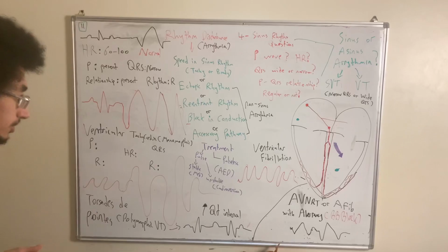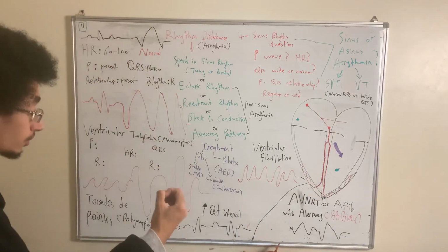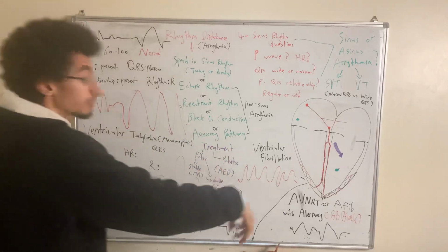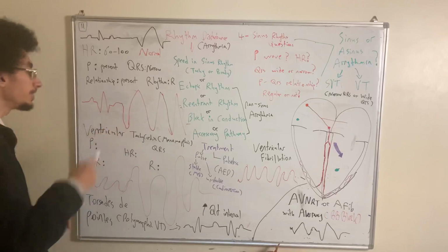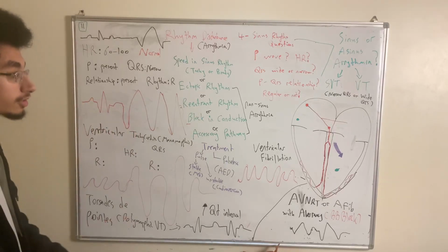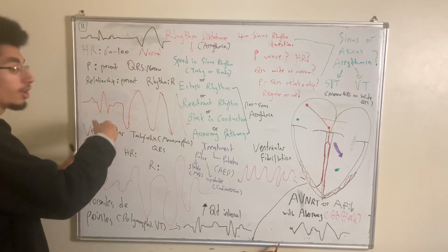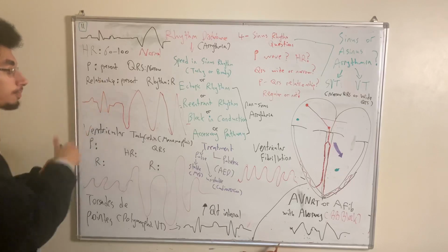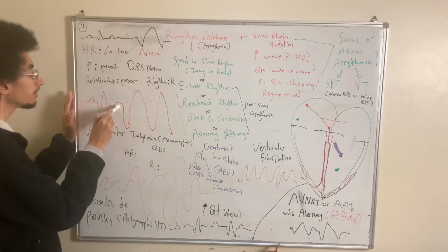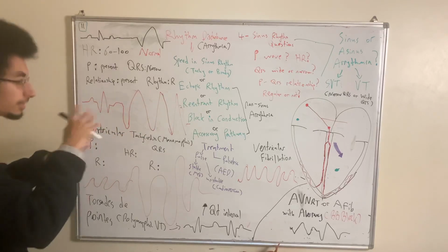So as a result of this ventricular pacemaker cell acting as an ectopic source, if it occurs very early, this will give rise to a PVC, premature ventricular contraction, which occurs as soon as, or even before, the normal sinus beat finishes its repolarization, because you have a T wave and then literally, as soon as possible, the PVC immediately functioning.